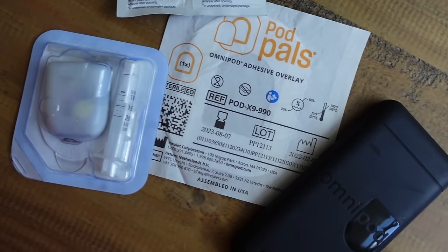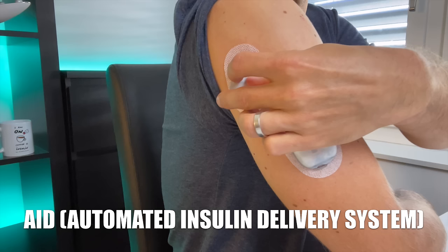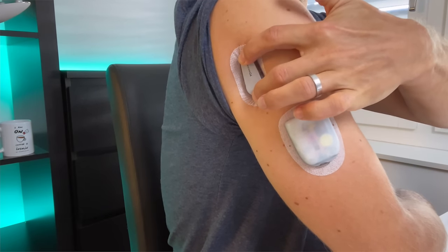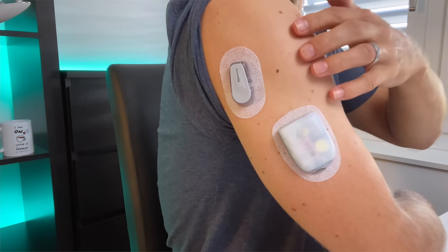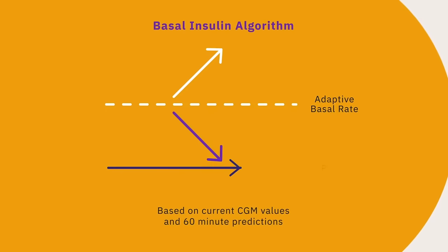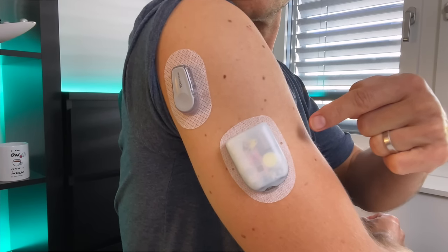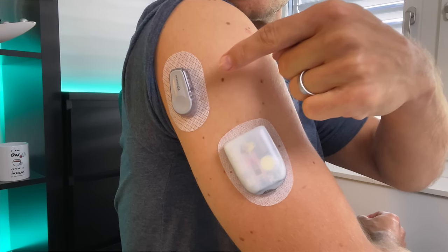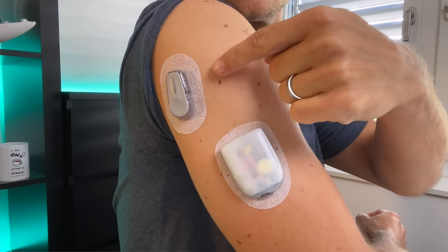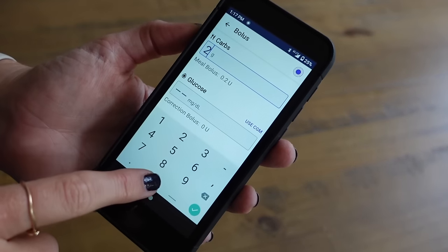The new Omnipod 5 is an automated insulin delivery system and it's the first ever tubeless AID connected to a continuous glucose monitor. This means that the amount of insulin delivered by the pod changes based on your current blood glucose and based on what your blood sugar is predicted to be 60 minutes into the future. The Omnipod 5 system consists of three parts: the pod which is placed on your body, the continuous glucose monitor also placed on your body, and the controller which you can use to control the system. The controller is included in the Omnipod 5 intro kit but you can also use a compatible smartphone if you install the Omnipod 5 app.